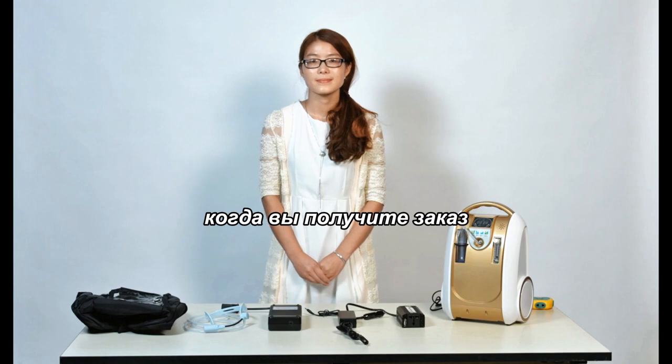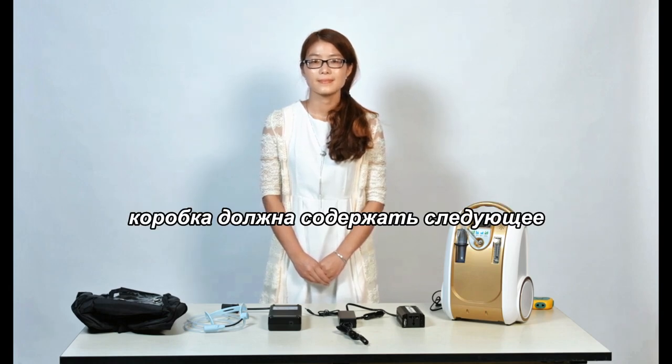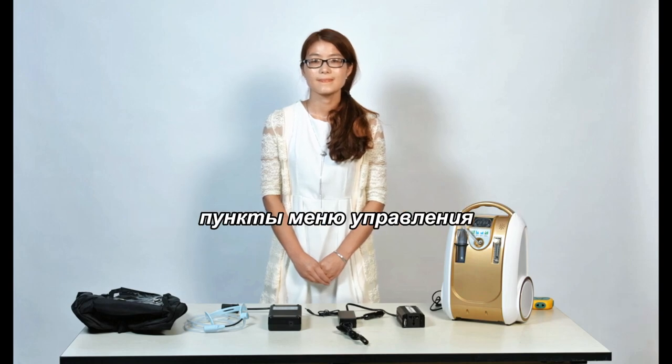When you receive the order, please carefully remove all the contents of the box. The box should include the following items in the operation menu.